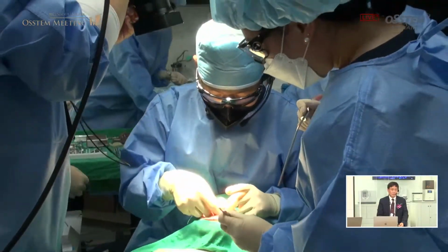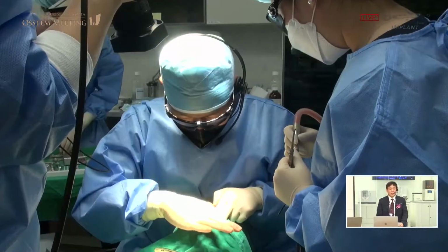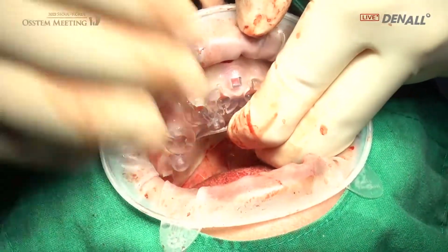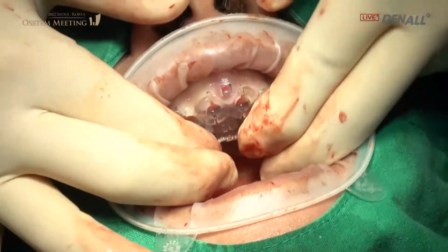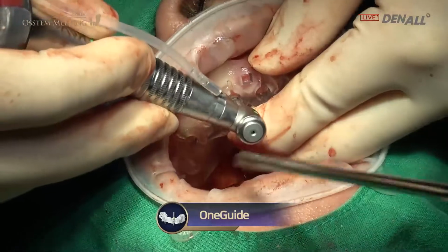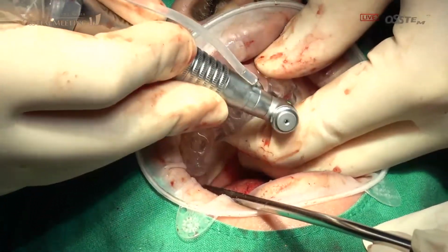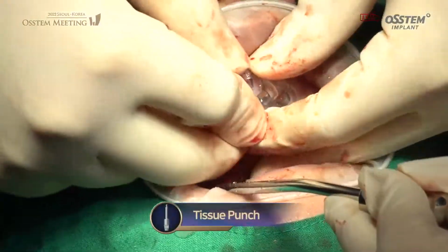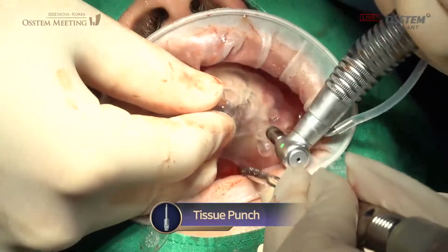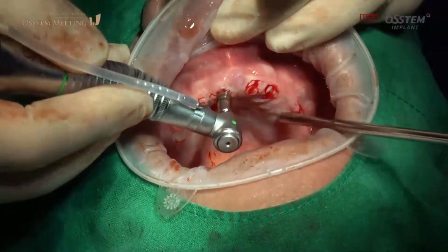The guide template we have prepared is going to be connected. I cannot hear the intercom. Can you hear me? Now I can hear it. The guide template is set. So the guide is fixated with the hand on the maxilla, and using a tissue punch, the indentations are made.